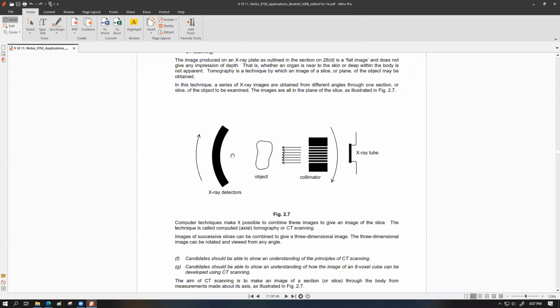If we reduce the pixel size, I mean voxel size, it means the smaller the size of the voxel, or the bigger number of voxels we're going to scan, the more precisely we should know in which locations we have bones, in which locations we have tumors, in which locations we have blood vessels, where we have nerve endings, and so on. So making the voxel size small is beneficial for us.